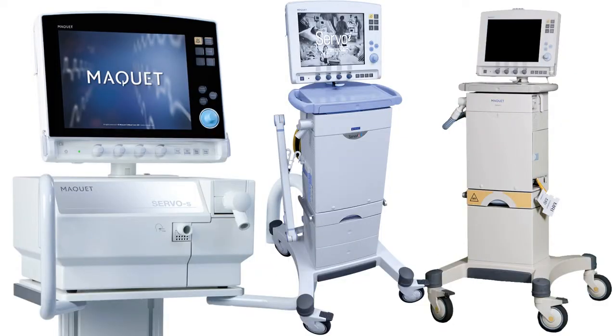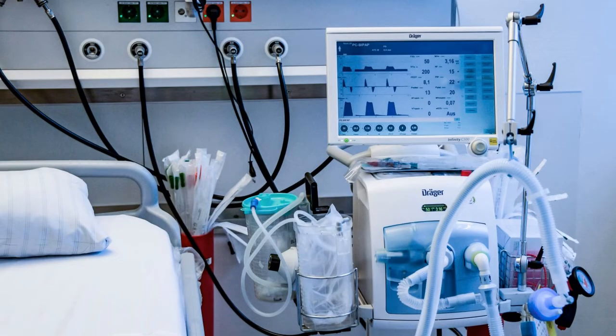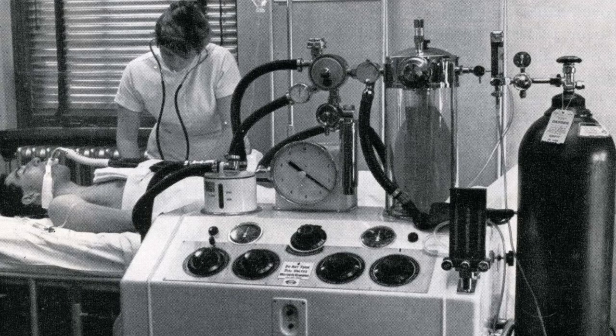Modern ventilators are state-of-the-art, sophisticated machines, a feat of modern engineering. They can provide delivery of oxygen to the patient's lungs either by controlling the volume or the pressure that is applied to the patient's lungs. We've come a long way from the mechanical ventilators of the previous century, developed because of the polio epidemic. And here is a short video.